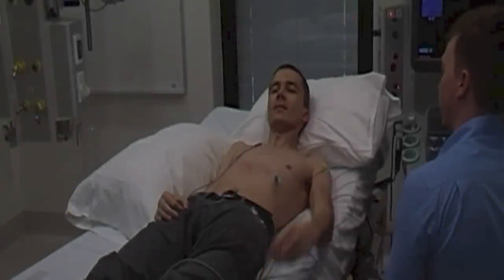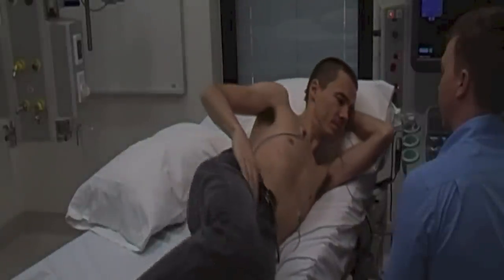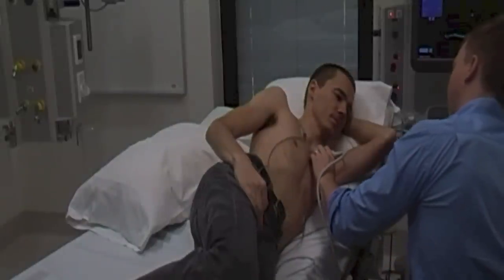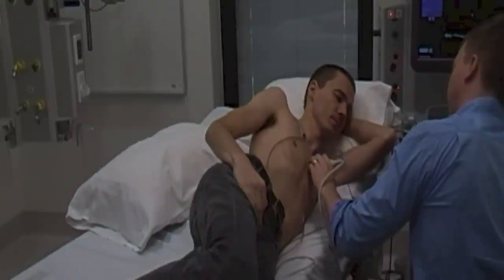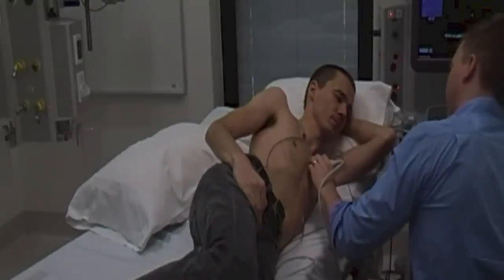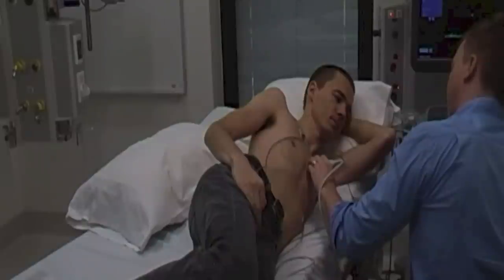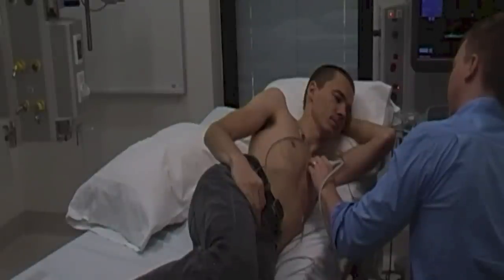Before you begin, it's important to position the patient in the left lateral position with their left arm bent up to support their head and their right arm resting alongside their body. Hold the probe in your left hand in between your thumb and your index and middle finger, ensuring that you anchor your hand on the patient's chest either with the ulnar surface of your hand or your other three fingers.